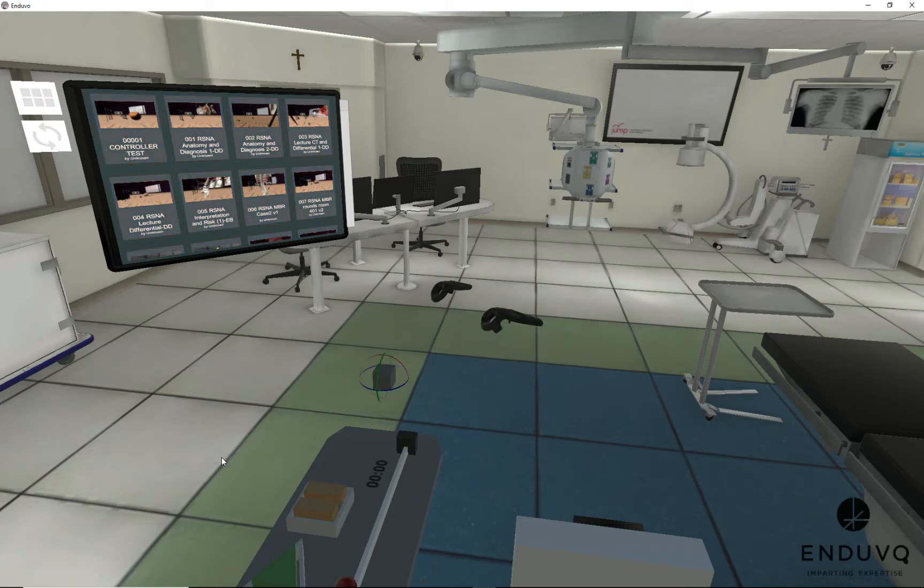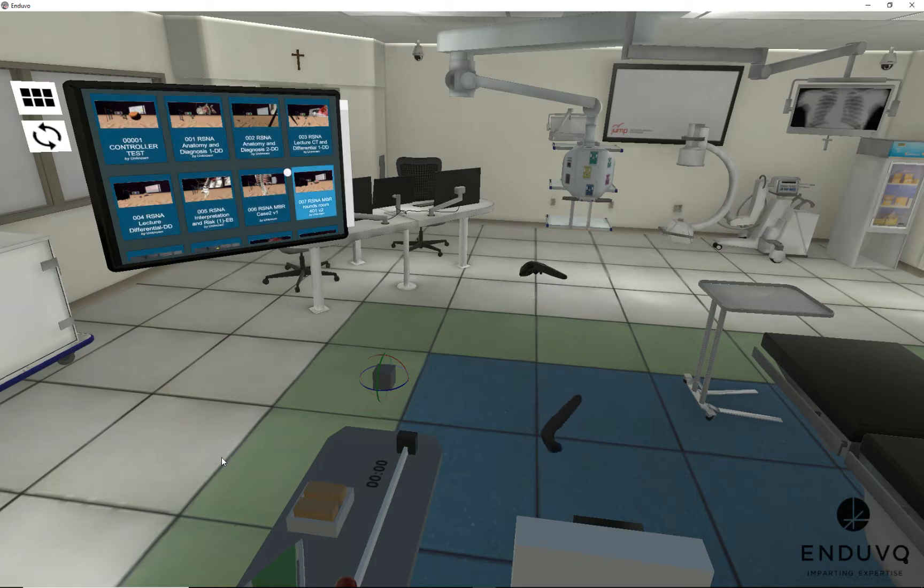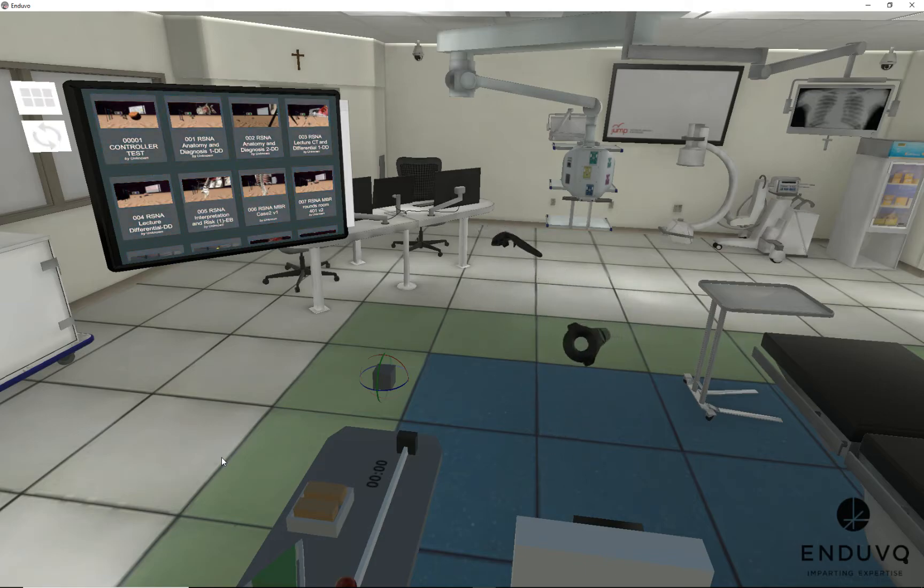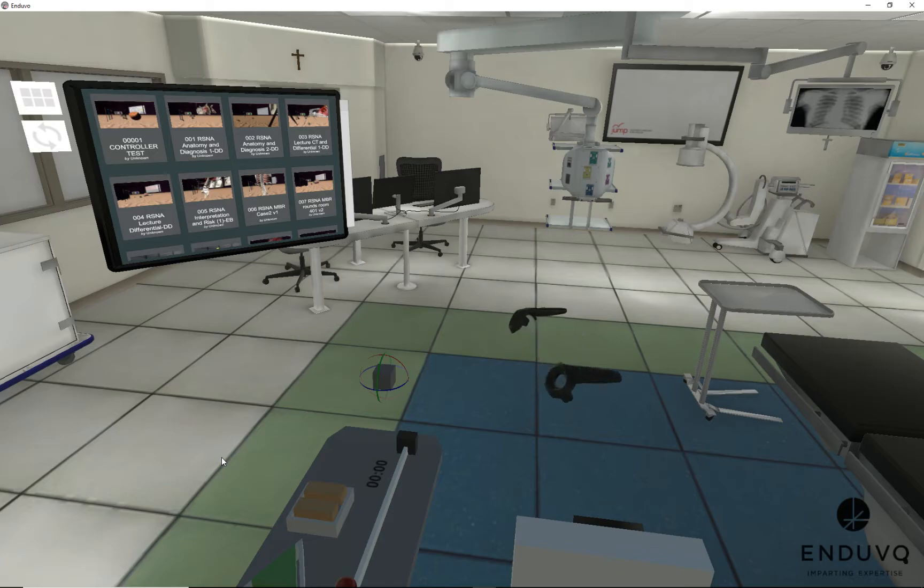And what we have here is our virtual reality education tool titled Enduvo. What you see in front of you is a virtual OR, but we have many different options.